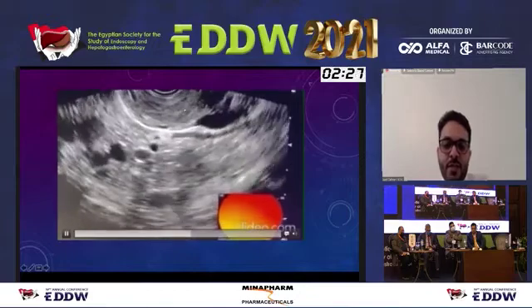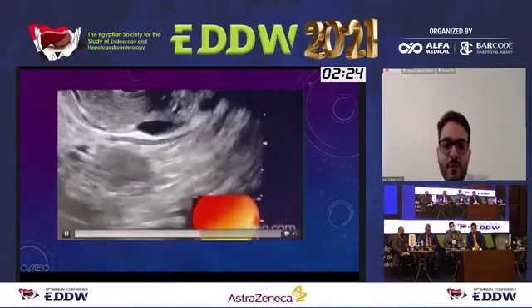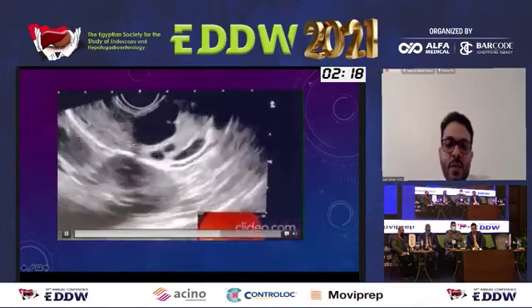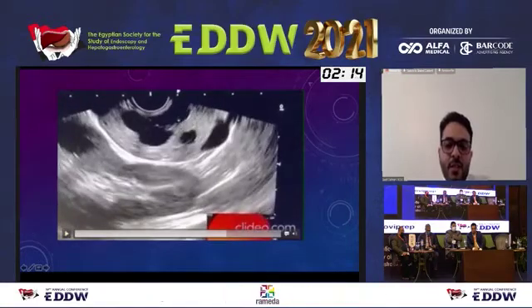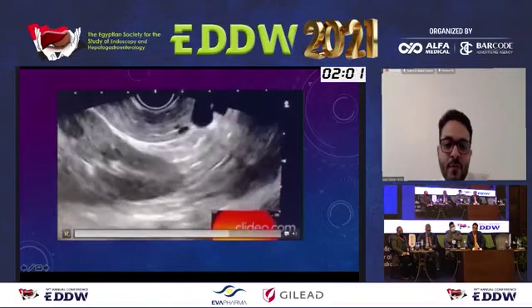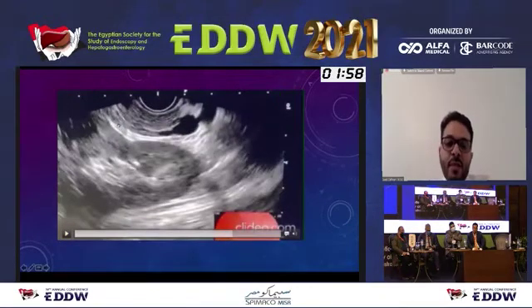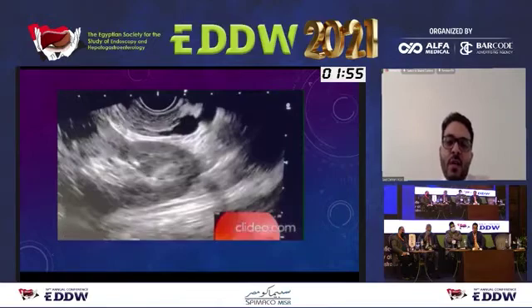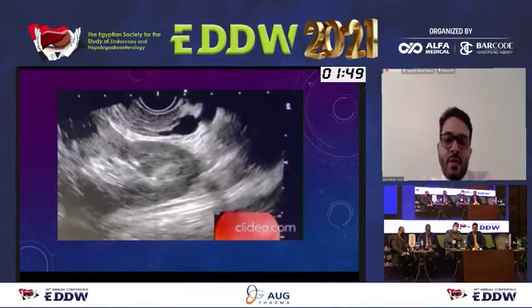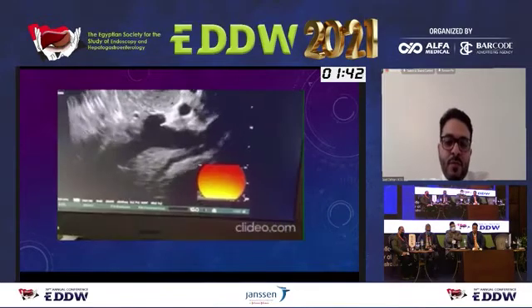And you can see here, moving to the tail of the pancreas, sorry for the bad quality of the video. And you see here another cystic lesion. It's a macrocystic septated lesion. It has large and small cysts at the same time. It has no high-risk features in terms of mural nodule or thick wall. So if you see multiple cysts communicating with the main pancreatic duct, this is branch duct IPMN, with no high-risk feature except the size. You don't need to refer the patient for surgery at this time, just follow up with images.